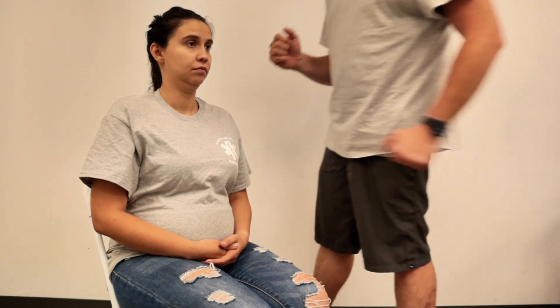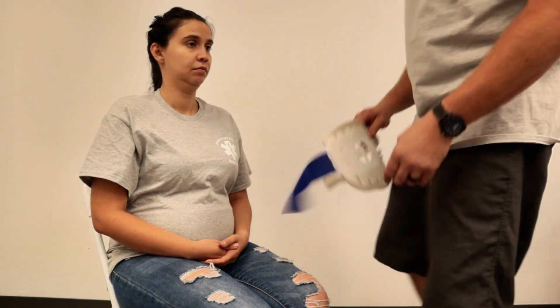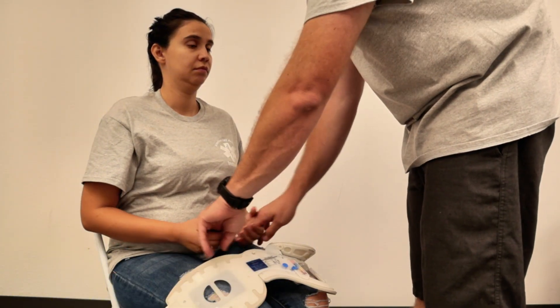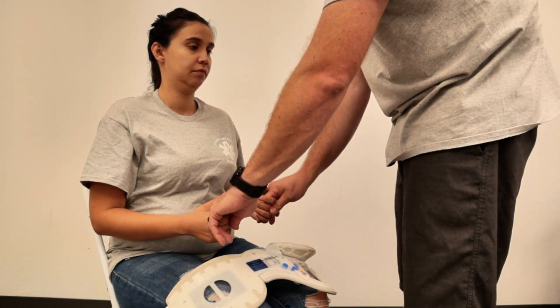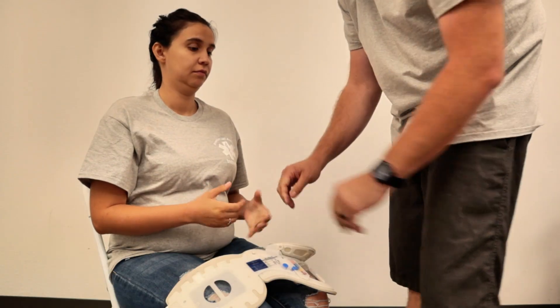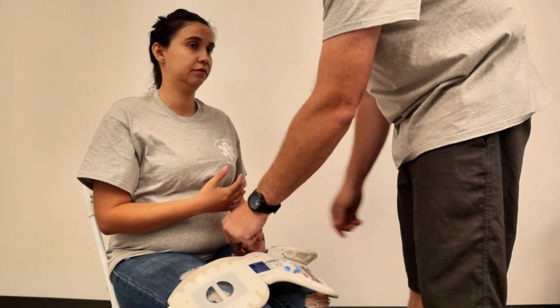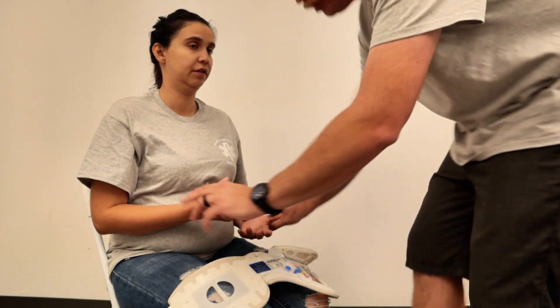I don't feel any crepitus or step-offs in this instance, so we can go ahead and grab a collar — have our collar ready. We're going to assess our CMS. I'm going to have her squeeze my finger as hard as she can. Which finger am I holding? Ring finger. Which finger am I holding? Middle finger.